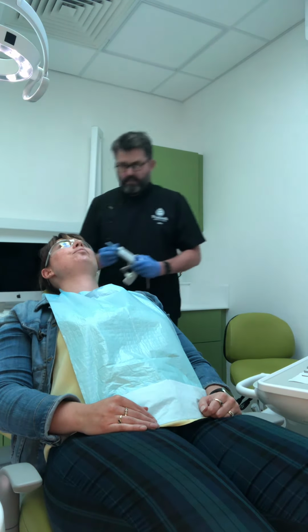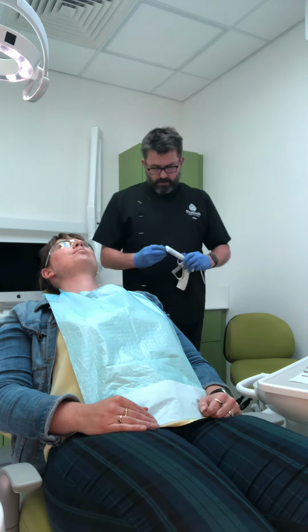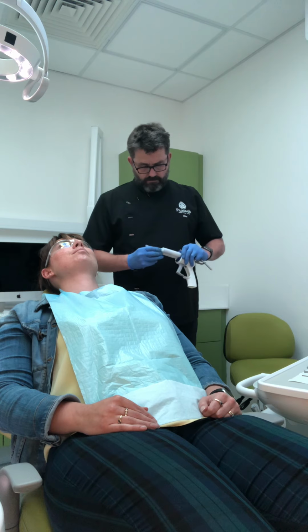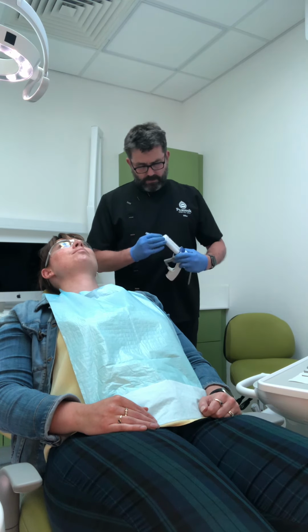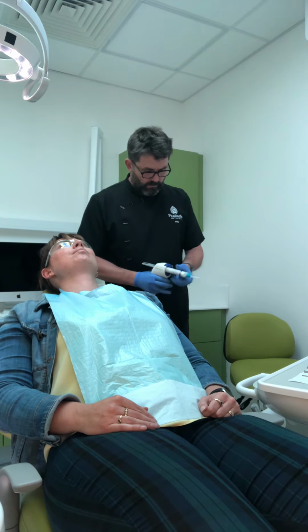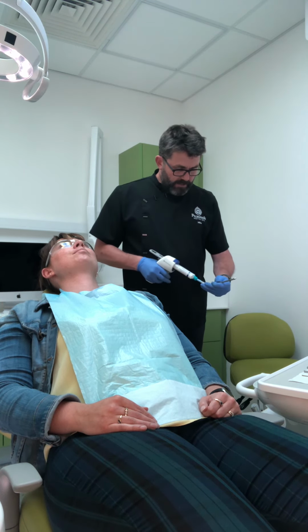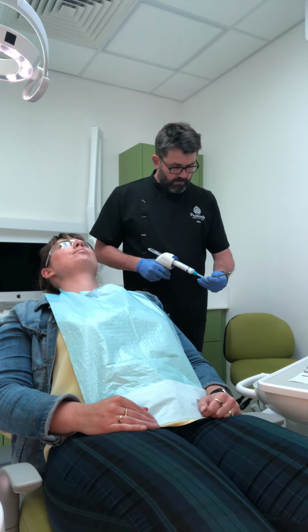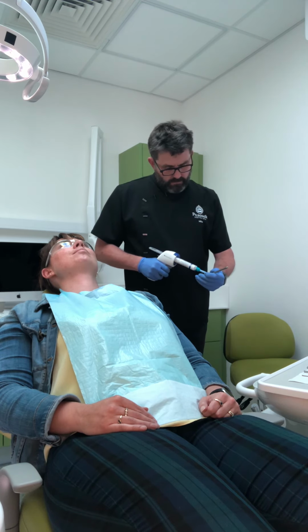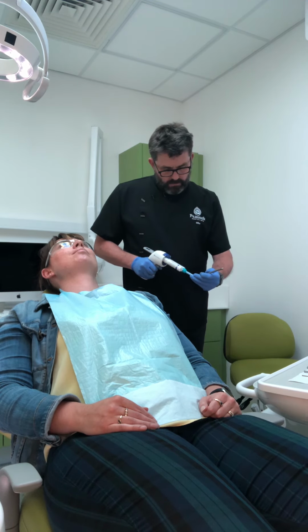The next thing is with a bite registration material. Get the nozzle on freshly so it doesn't set in between visits. And I'm just going to put a generous amount of the bite reg material on the bite fork. It doesn't take too long to set this, so I'm going to work fairly quickly. Super.